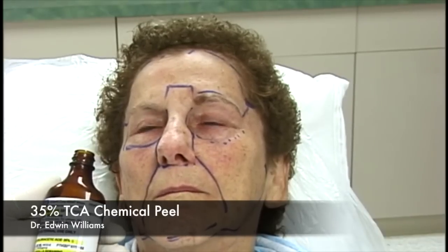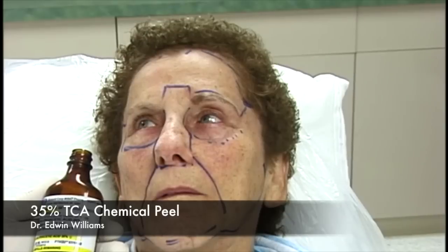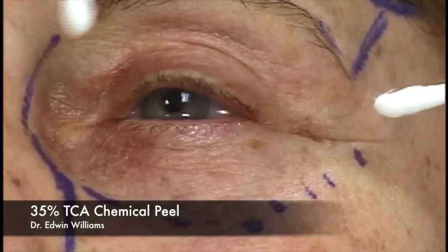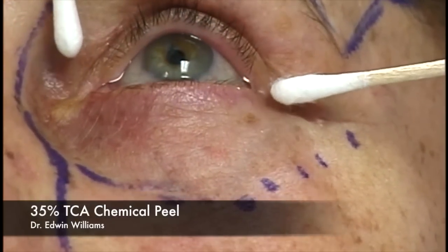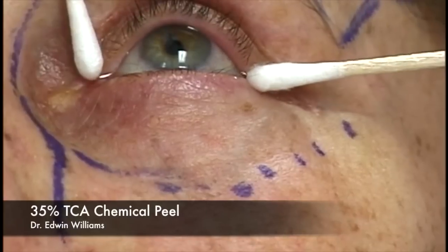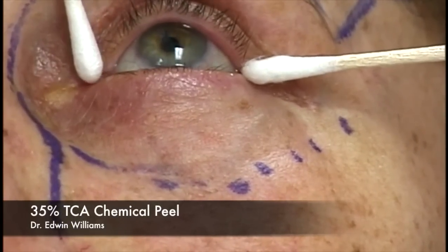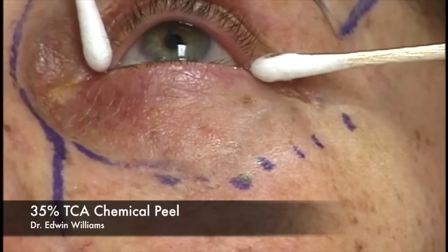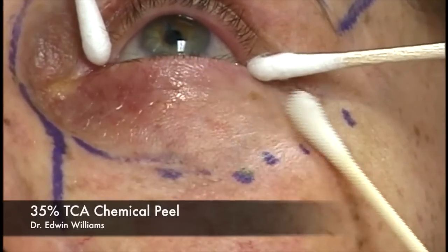We begin the peel; the patient has had one to two milligrams of Versed for the periorbital and eyelid area. Once we move past that we'll give a little more Versed and Demerol as we do the full face. The assistant reapplies Q-tips to wick tears, and we start on the left side, working systematically. This part really does sting; it's very important not to go beyond the subunit you are treating—it's very easy to over-treat.